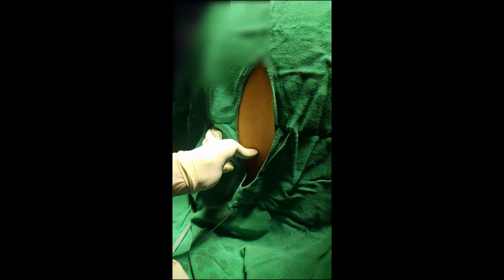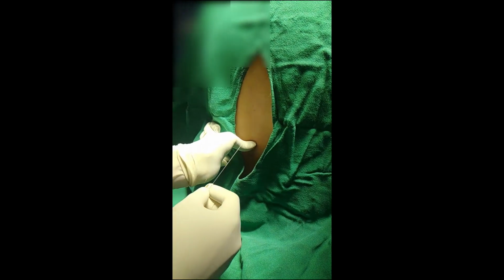Now palpate the lumbar space. Make sure you are in the L3, L4 or L4, L5 space. I am using L4, L5.